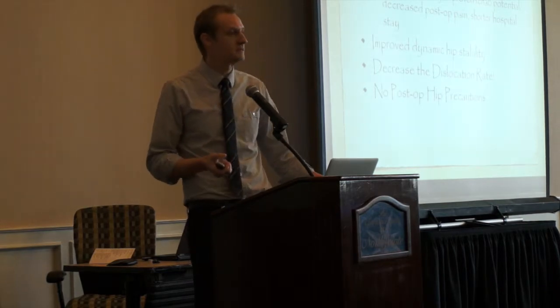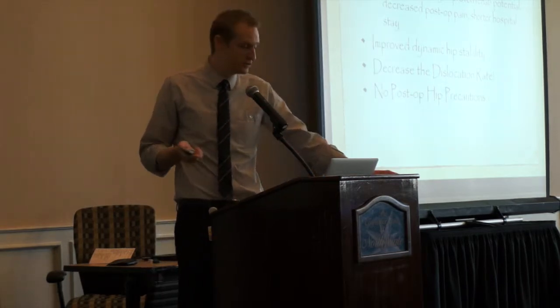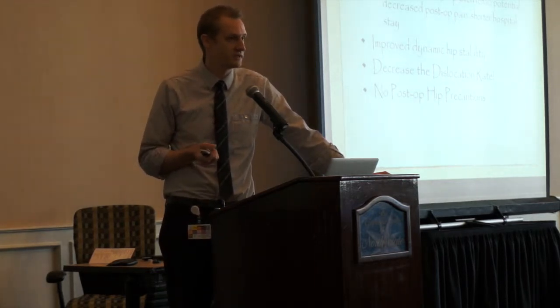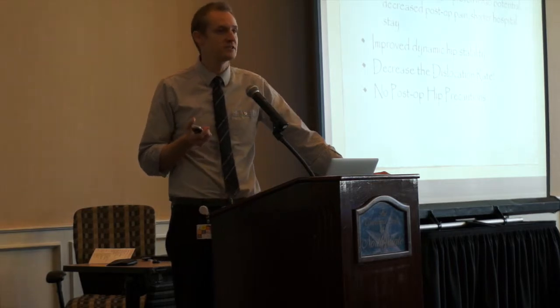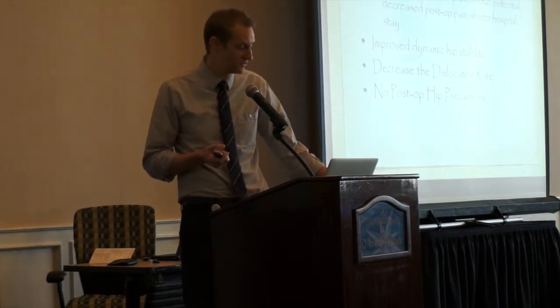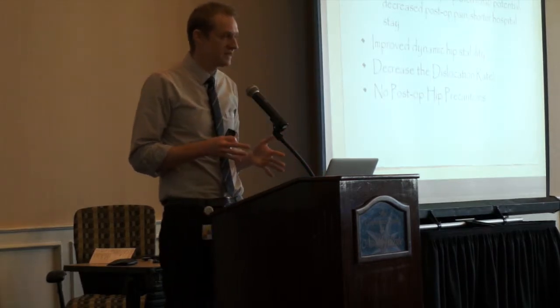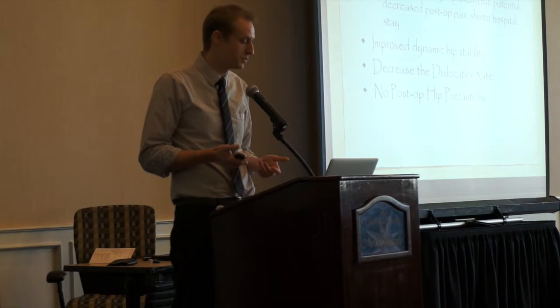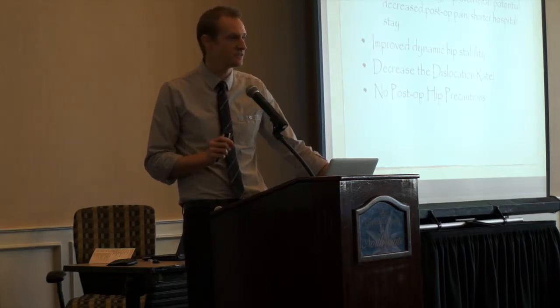So what does all of that mean for the anterior approach? Some of the proposed benefits of the anterior approach to total hip arthroplasty have to do with muscle preservation and attachments. Essentially, there's no muscle cut or released during the anterior approach, and we'll get into the differences a little bit later between the traditional approaches. Ultimately, this muscular attachment and less surgical trauma lead to patients recovering faster, having an improved rehab potential. They can ultimately have decreased post-op pain and a shorter hospital stay. Ideally, the hip itself becomes more stable. By not releasing muscles around the hip, the dynamic stability of the hip improves. There's a lower dislocation rate with the anterior approach, as well as convenience factors for patients.